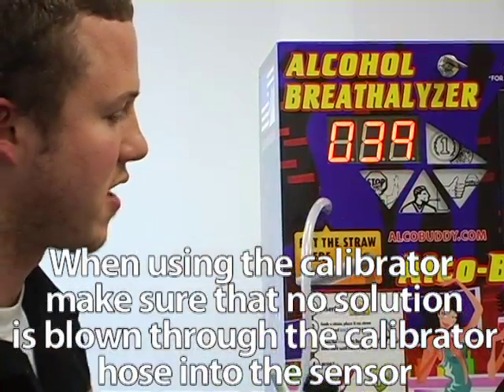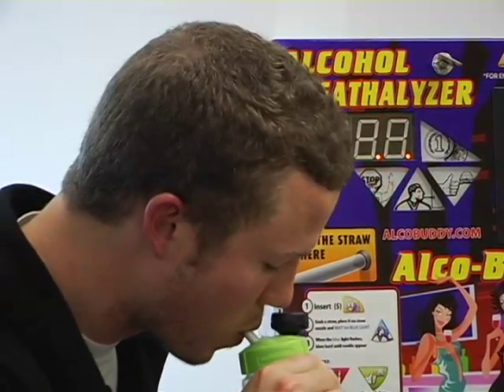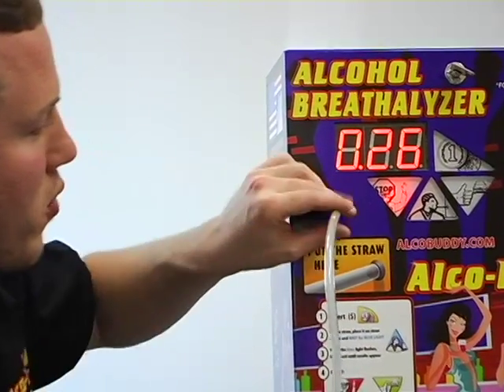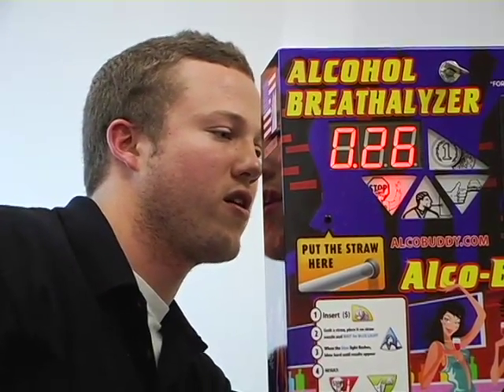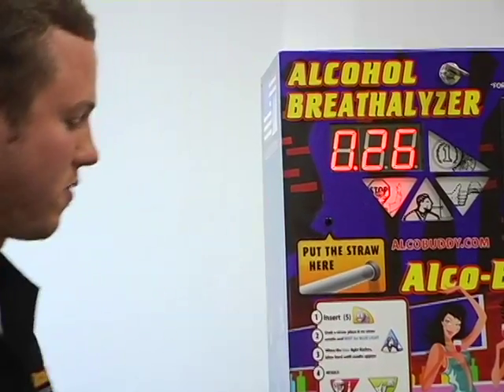As you can see, 10 seconds is counting down, so I am going to get ready to blow into the machine. As you can see, it came up 0.26, so it is a little low. I am going to adjust it on the screw back here — turn it clockwise about half a revolution — and we will see if that does it.